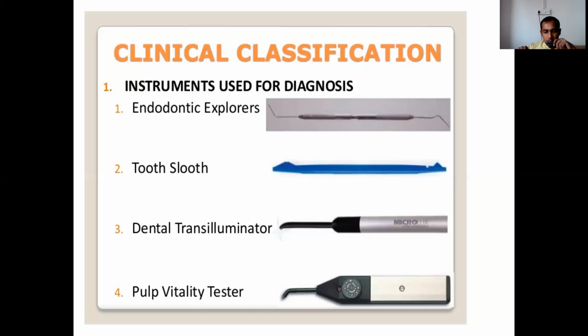We have to insert the lip clip into the patient's mouth, and we have to make the probe touch the patient's tooth to be tested. Once the patient feels a tingling sensation of warmth, then the tooth is vital. If there is no response, the tooth is non-vital.